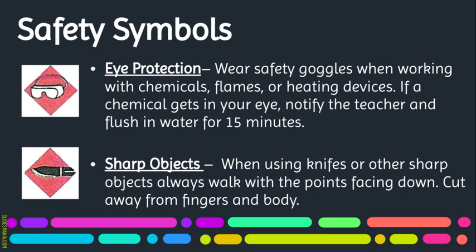It doesn't come out hard. It's not going to hurt your eye. And we're just going to kind of hold your eye and gently stick your eye in the water. It's not any different than swimming pool water, although this doesn't have chlorine in it. And afterwards, we'll let Mrs. Sprada know, and I'll send you down there, and she'll take a look at it, and she'll suggest whatever she thinks needs to happen. And of course, mom and dad will know, and things like that.